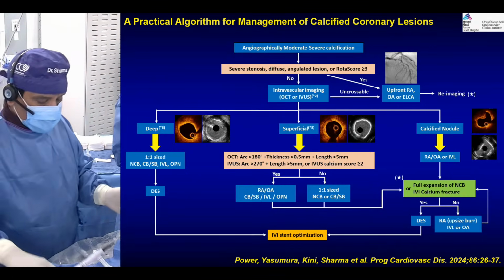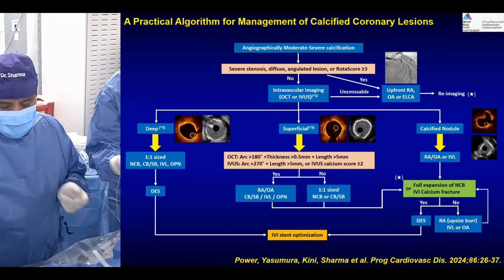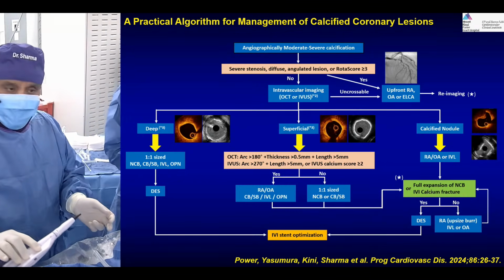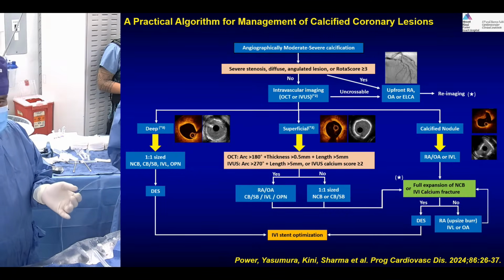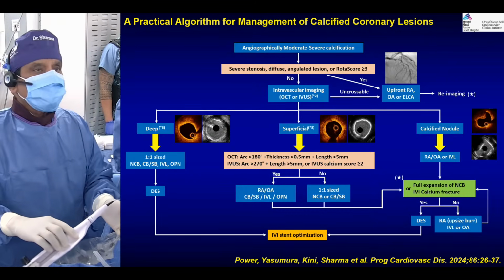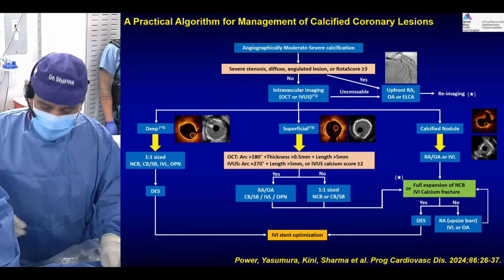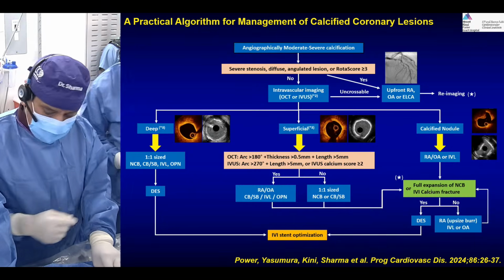And sometimes with very calcific lesions, unless you pre-dilate, which was done in the Disrupt CAD III trial, almost 55%, routine balloon maybe even more, then IVL may be a little troublesome because a ruptured balloon has created a little bit of dissection. So with circular calcium, which is 360 degrees like this, we try to do the atherectomy, and if you need to, then combine with IVL. But yes, if somebody wants to do IVL, that's okay. Somebody wants to do OA in this case, that's okay.